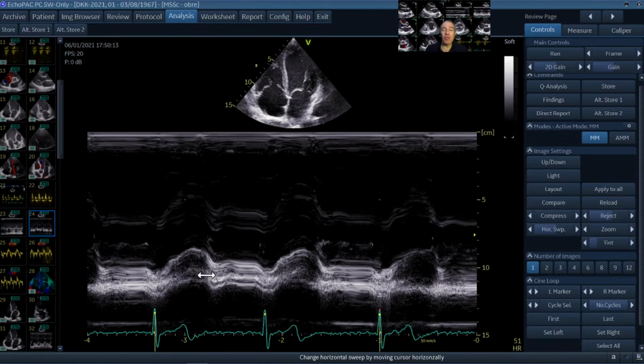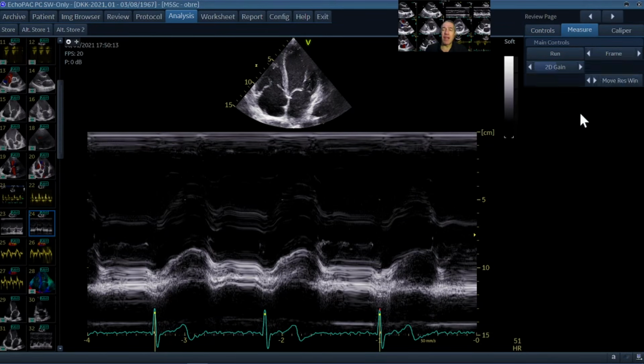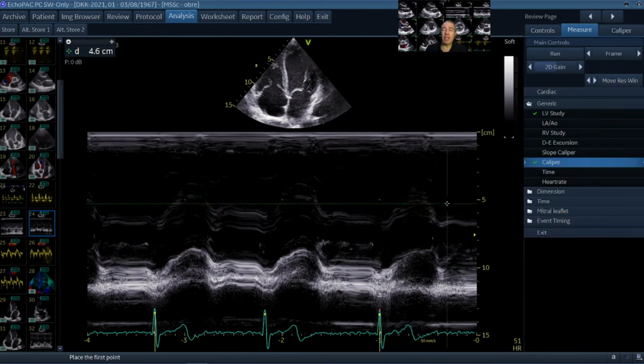And we can also do this for the lateral level. So this is here across the lateral aspect of the mitral valve. And again, I use a generic measurement, and I measure typically a little bit more at the lateral level, 16 millimeters motion in the apical direction.